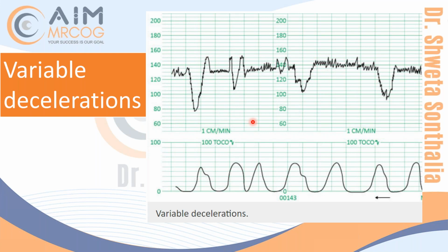So this is how they make the scenario. So in the exam, open your eyes, ears, everything, and try to read the scenario and at the same time interpret the CTG correctly. Then you'll definitely get the right answer.